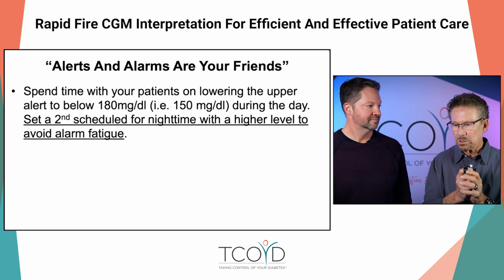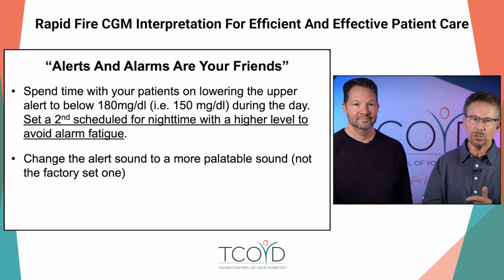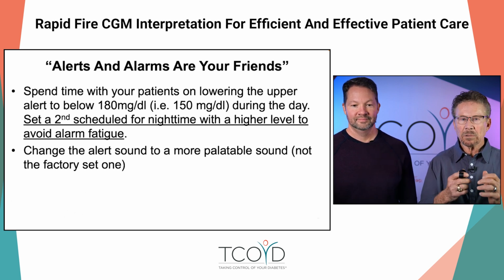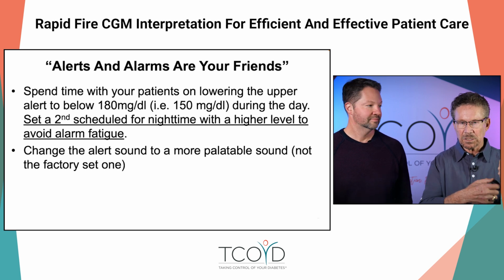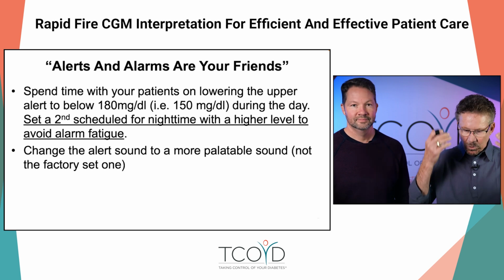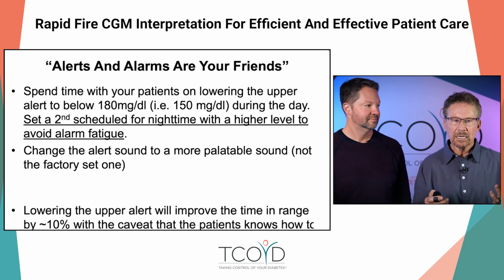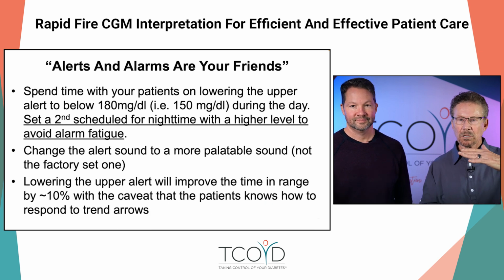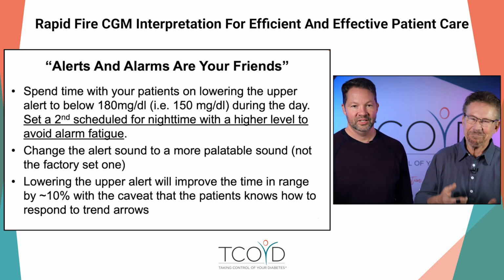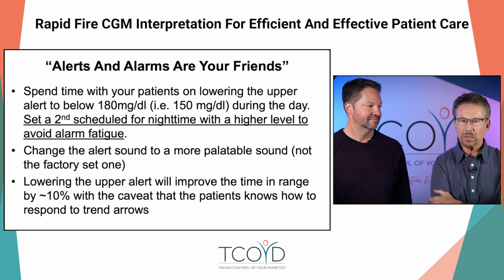And once again, patients have to change their mindset because a lot of people hate the alerts and alarms. And my other suggestion, which is important, you can change the alert sound on some of these CGM devices. And the one that comes with the factory is pretty obnoxious. And that's the one patients equate with bad. Yeah. You're a bad diabetic. And there's a lot of cool sounds. And lowering the upper alert, I don't know if anybody's ever done this study. I've been quoting 10% because that's my anecdotal experience, but it's really true. It could make a significant improvement in time in range.